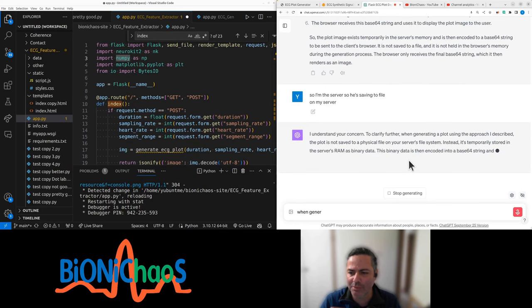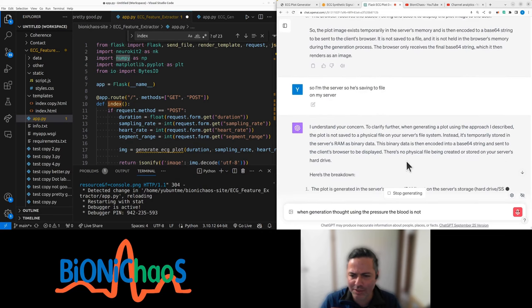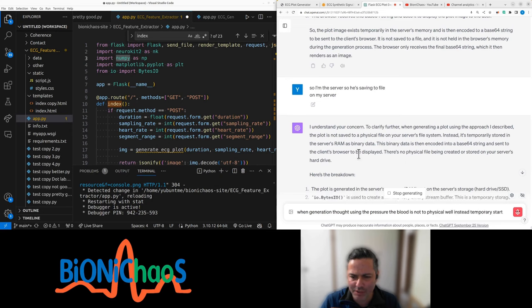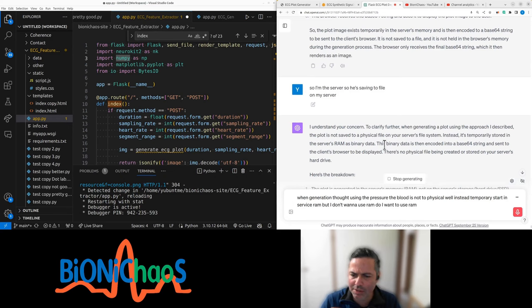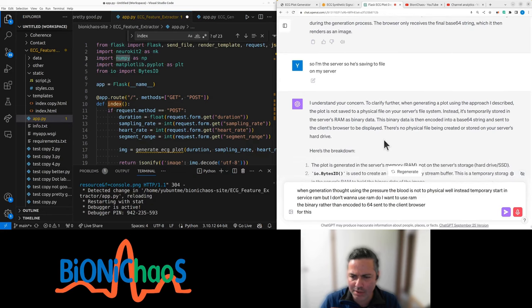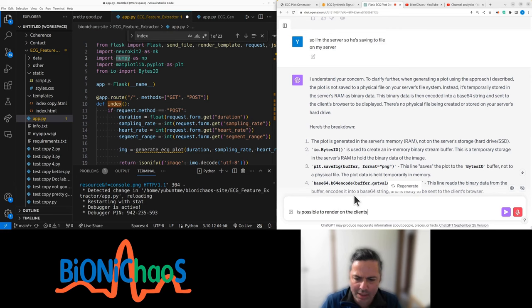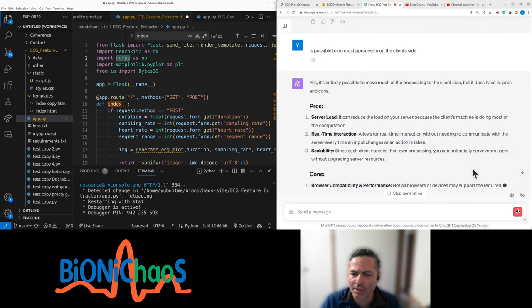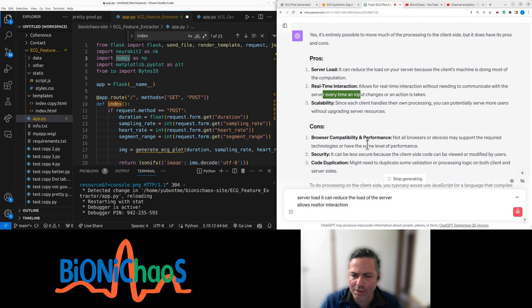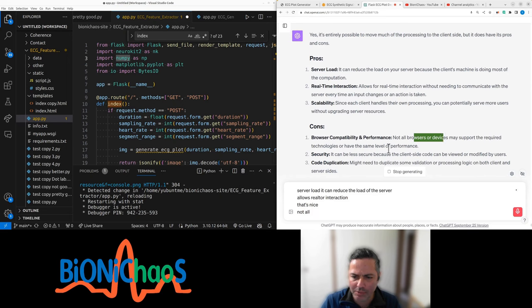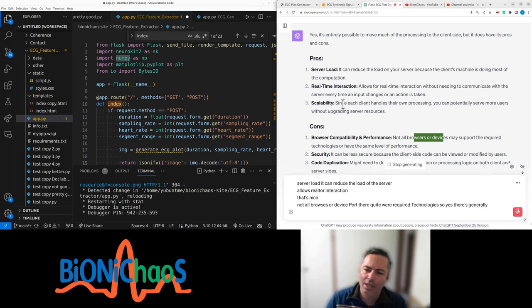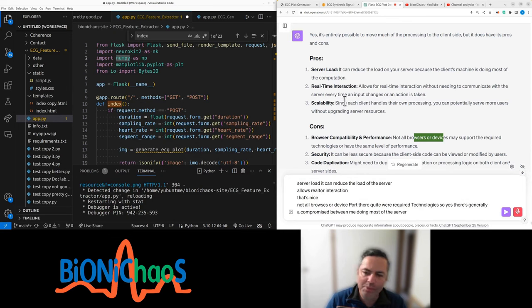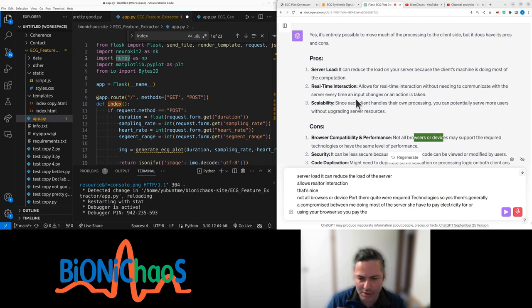When generating plot using the approach I described, the plot is not saved to a physical file. Instead, temporarily stored in server's RAM. But I don't want to use RAM, do I want to use RAM? Is it possible to render on the client's side? It can reduce the load of the server, allows real-time interaction. There's generally a compromise between me doing most of the server, which I have to pay electricity for, or using your browser so you pay the electricity bill.